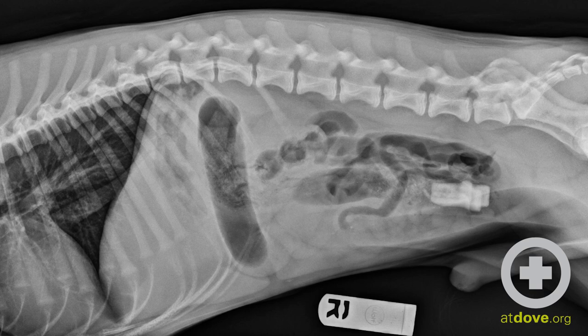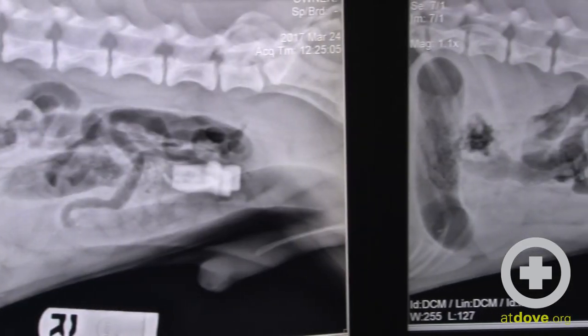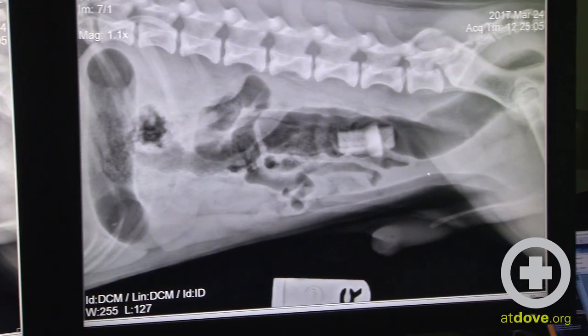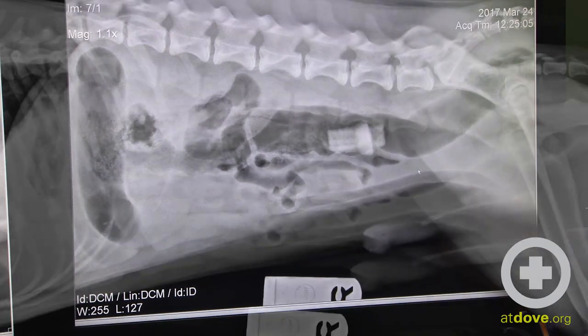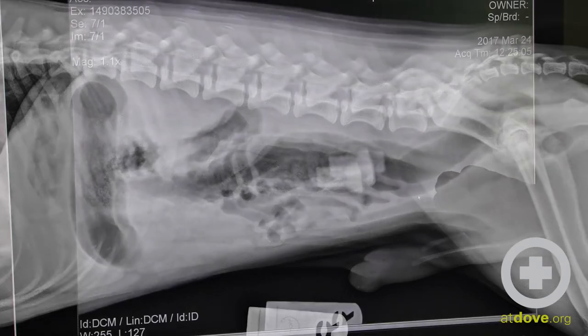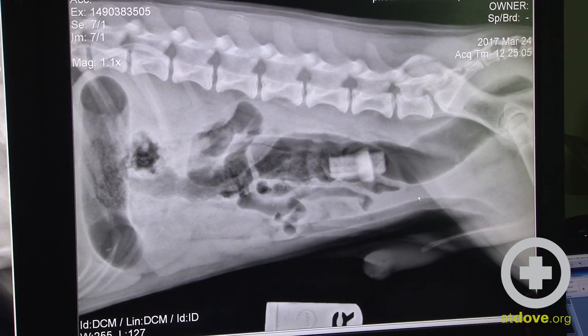The ventrodorsal view did not give us any additional information, so the veterinarian on staff did a pneumocolonogram. A pneumocolonogram is basically where you instill one mil per pound of air — room air — into the rectum in a retrograde fashion. That gas will delineate the outlines of the colon, which is very helpful for us to discern what is colon and what is not colon.